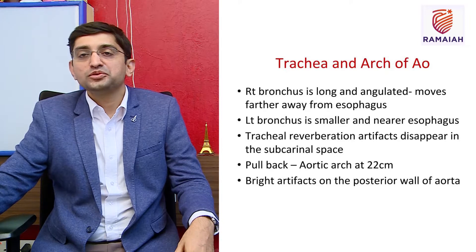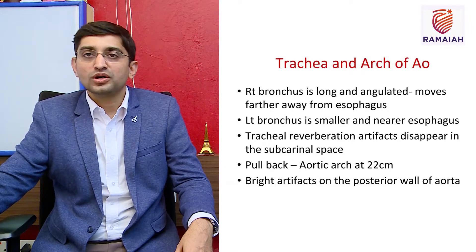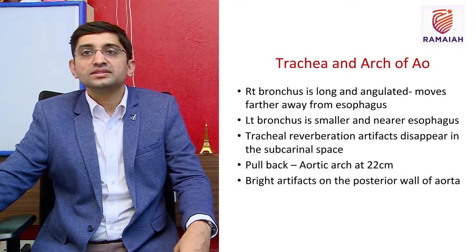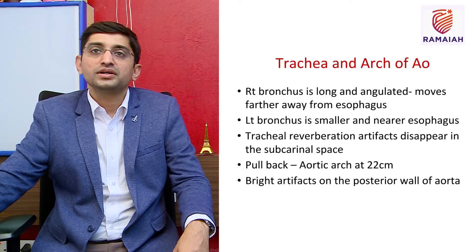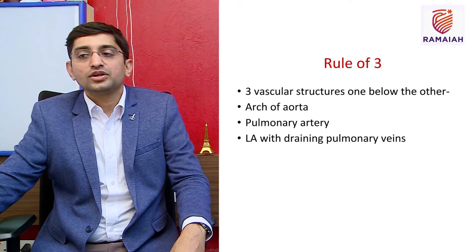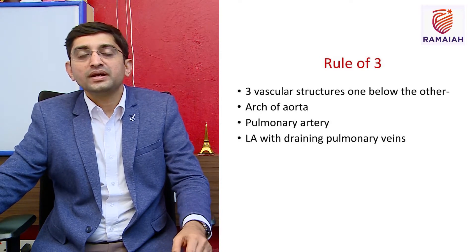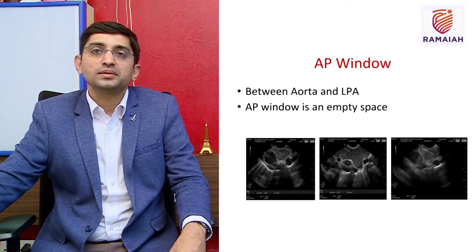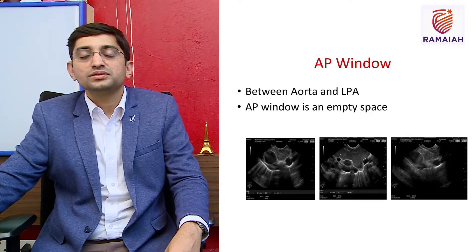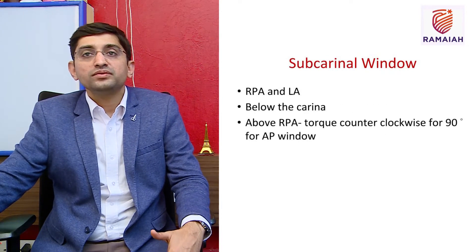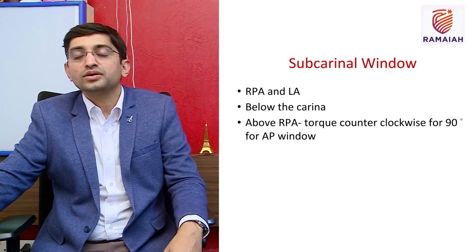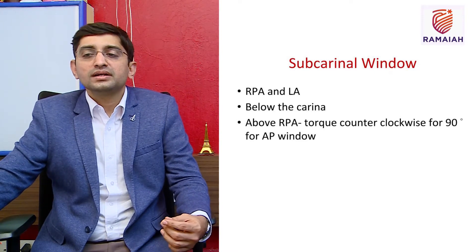Above the left atrium is the right pulmonary artery, and between the right pulmonary artery and the carina is the subcarina space. The trachea produces reverberation artifacts due to its C-shaped cartilages. The right bronchus is long and angulated, farther from the esophagus, whereas the left bronchus is shorter and nearer to the esophagus. There are also bright artifacts from the posterior wall of the aorta.